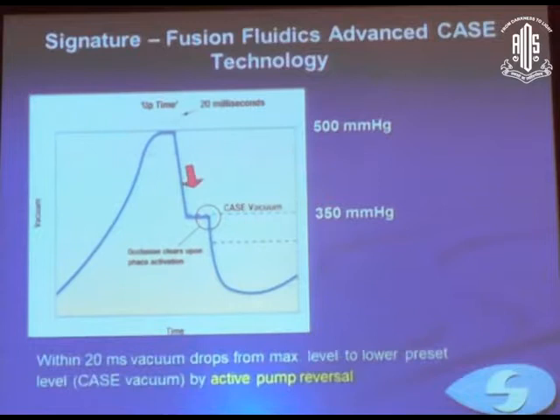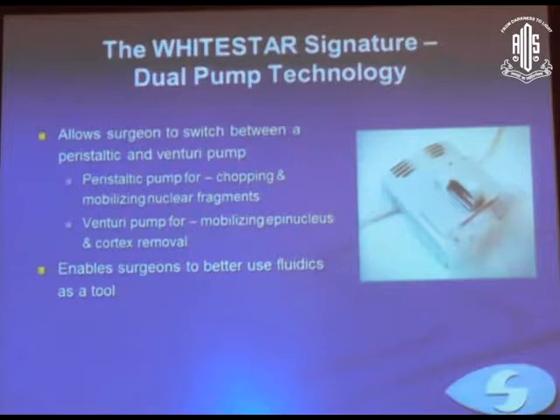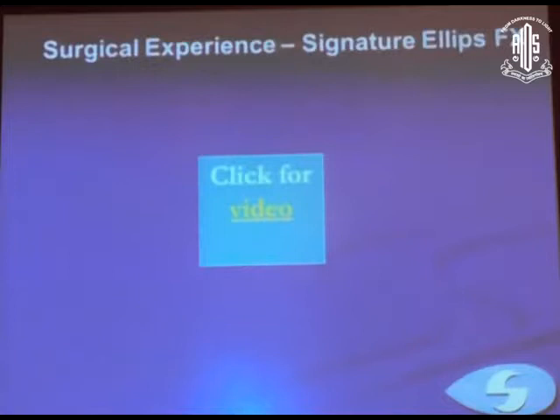The other thing is the occlusion mode. And how does the occlusion mode work? The aspiration flow rate is different at different stages of surgery, and that is how the occlusion mode works. Now, this Signature has both the pumps, the peristaltic pump and the venturi pump. The peristaltic pump is good for chopping and mobilizing nuclear fragments, and the venturi pump is good for mobilizing the epinucleus and the cortex, and therefore enables the surgeon to have better control over the fluidics. And a short video.